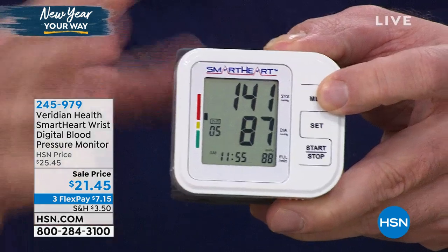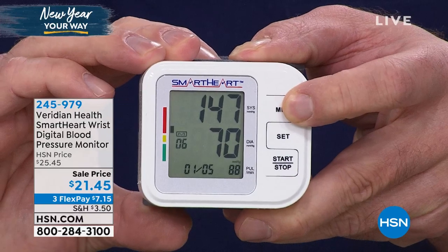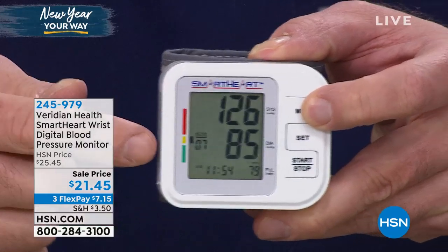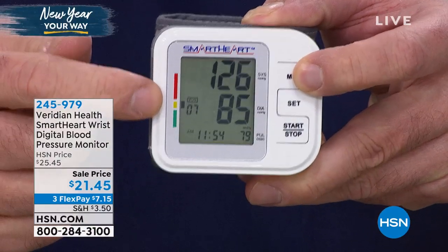It's frightening, and we're making those New Year's resolutions. So many of you have purchased this because you know that Viridian does it right — it's a name that you can trust. Clinically accurate readings mean that you can count on the readings. You're going to be able to store up to 60 readings in memory — that's two months worth of readings.